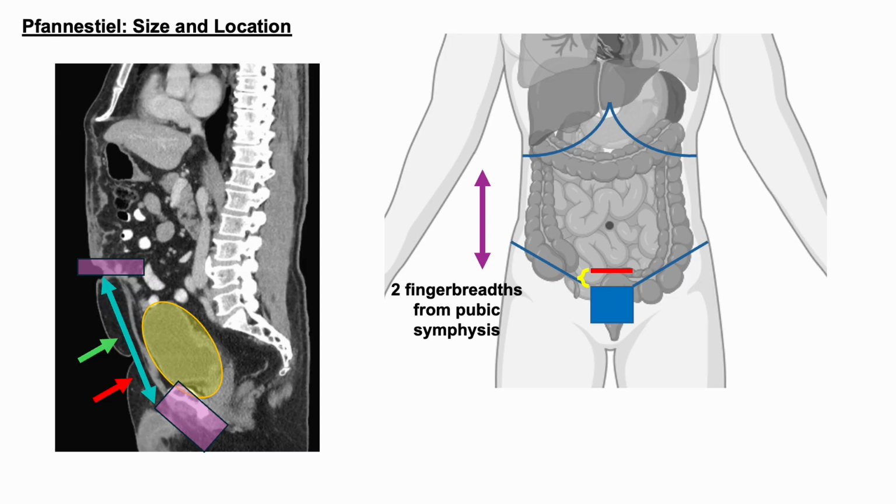The second potential advantage is that sometimes a surgeon may want to use a contour stapler through the Pfannenstiel incision in an extracorporeal fashion. I don't do this in my own practice, but the lower you make your Pfannenstiel incision, the better view into the pelvis and ease with stapling you will have on the rectum.